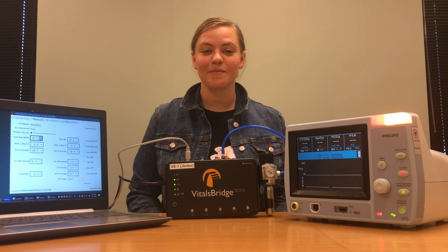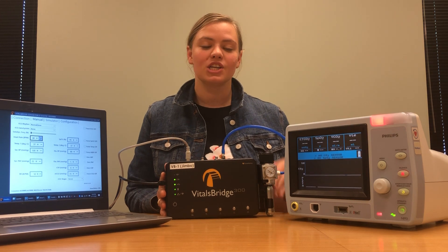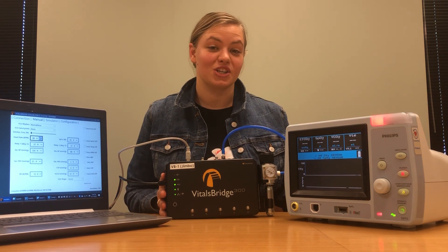Hi, my name is Hailey and today I'm going to show you how to connect the VitalsBridge 300 mainstream unit to a Philips mainstream capnography patient monitor.